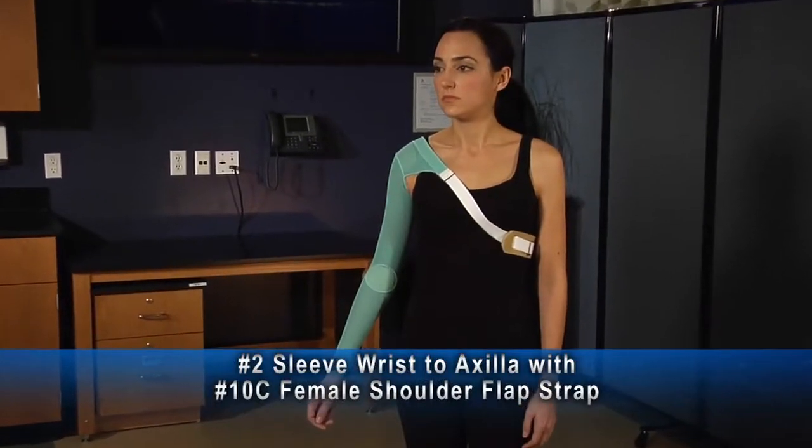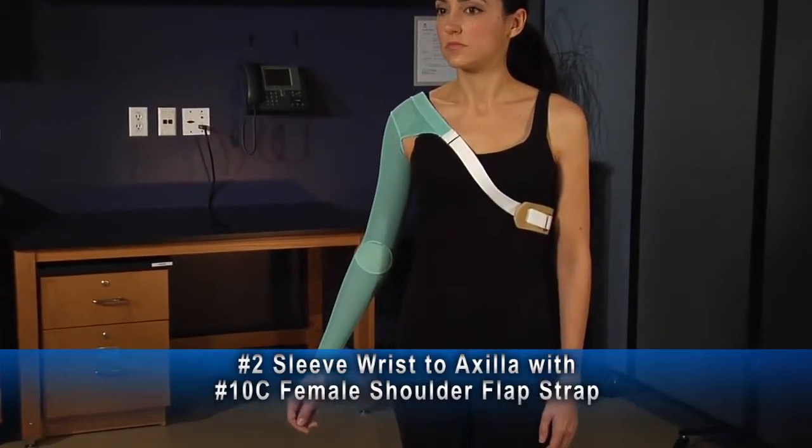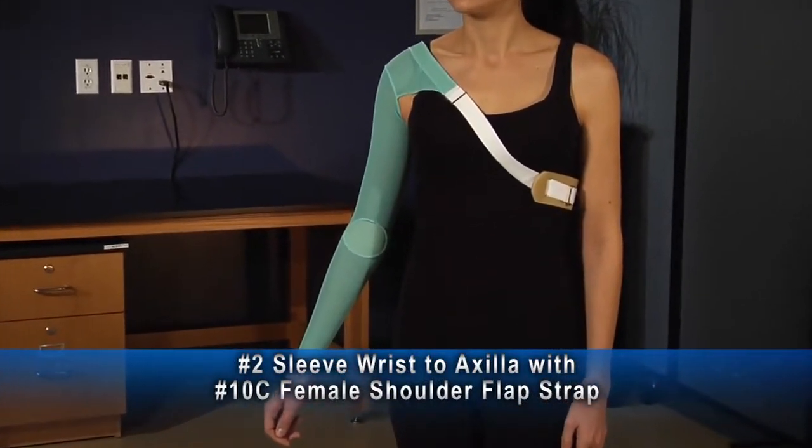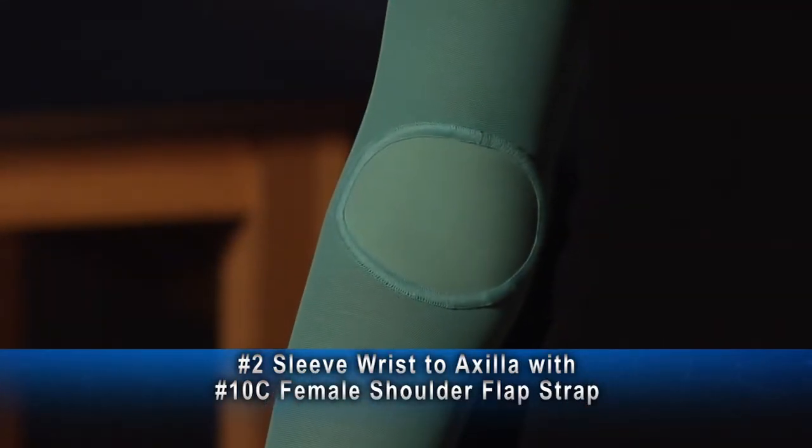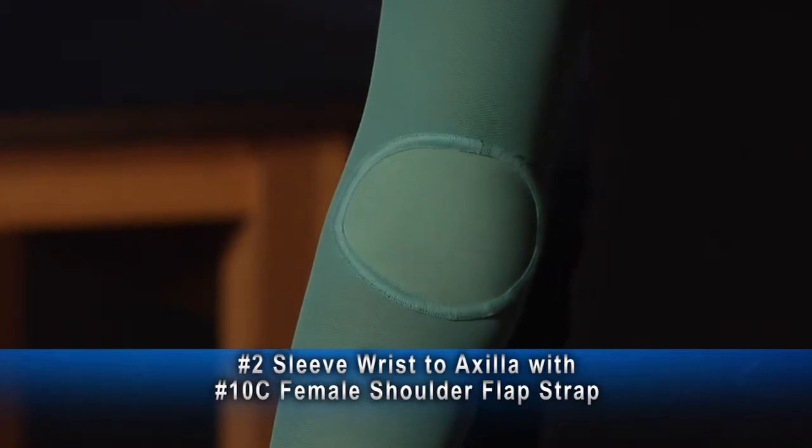This female shoulder flap with sleeve to axilla pressure garment is shown here with an optional anterior elbow insert to prevent the irritation that can occur with bunching of the fabric in the elbow crease.